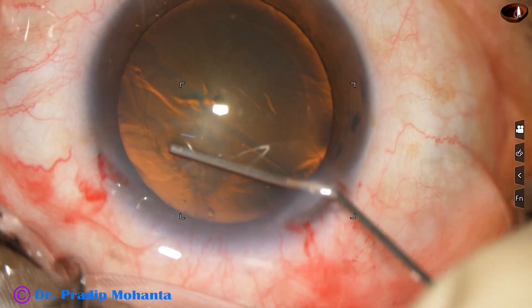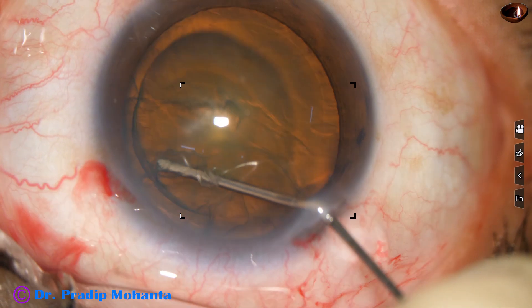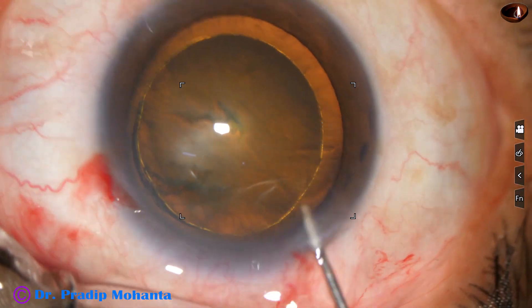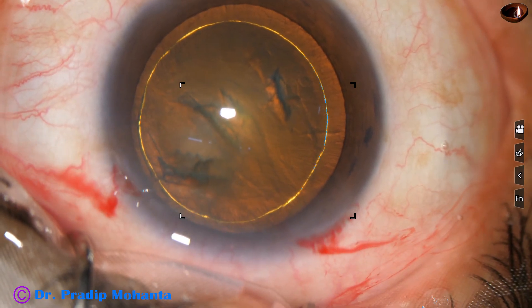Now hydrodissection is done with the help of a 27-gauge cannula. Hydrodelineation is also done. We have got a nice golden ring in this case.